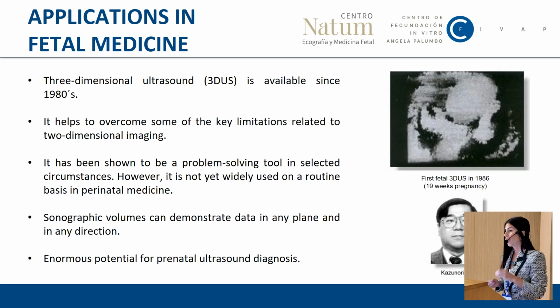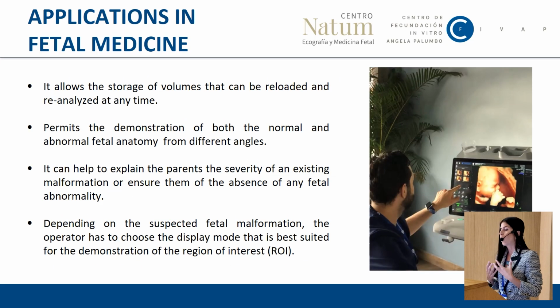Moreover, we can store not only images but also volumes that can be reloaded and reanalyzed at any time, even without the patient in the room. The availability of several display modes allows the demonstration of both normal and abnormal fetal anatomy from different angles.